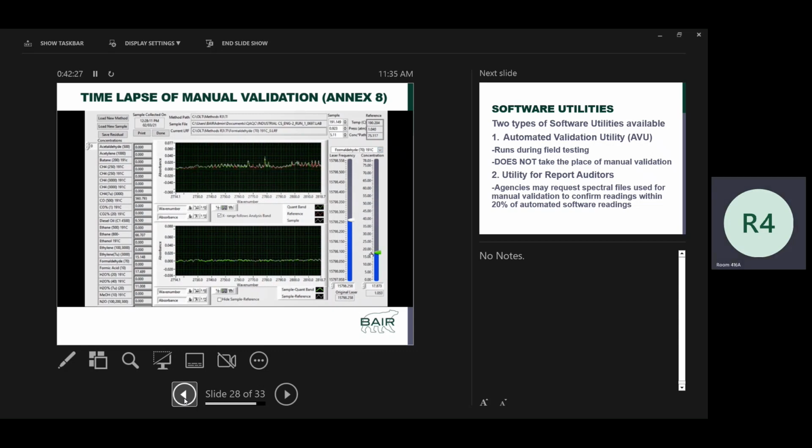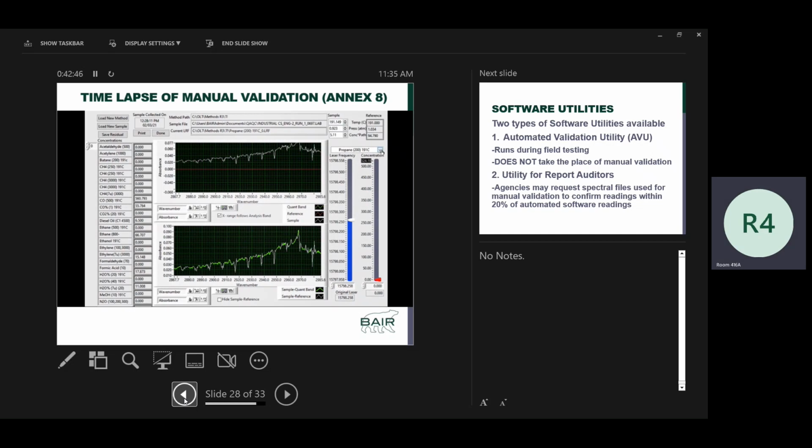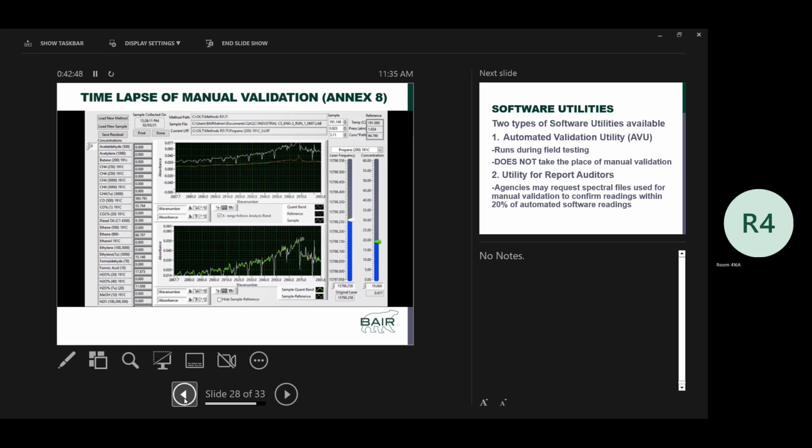Because once you become really accustomed to doing manual validations like this, manual quant, as they call it, becomes second nature, and you just go through it, one by one by one. The other thing is you have to do this on a point that is close to the average and then an outlier higher row for each run. So you have to get 2 points per run.